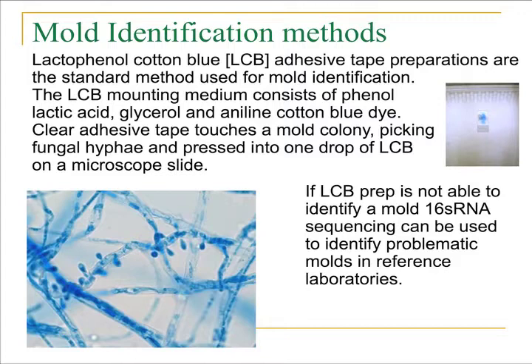If you're not able to identify the fungi using these phenotypic characteristics, you can use 16S RNA sequencing, and it is the best technique to use for problematic molds. However, the only laboratories capable of doing this are more your reference laboratories in mycology.